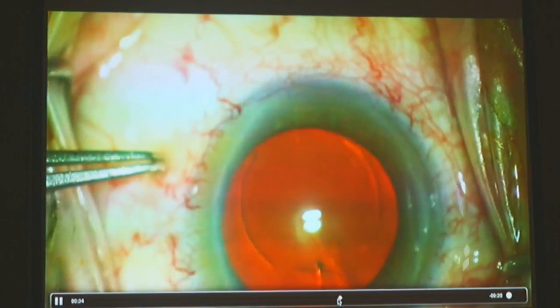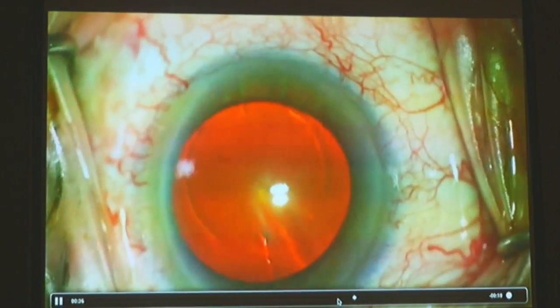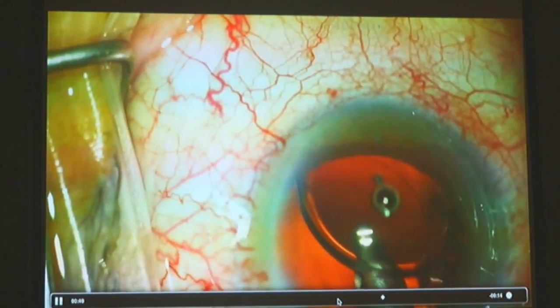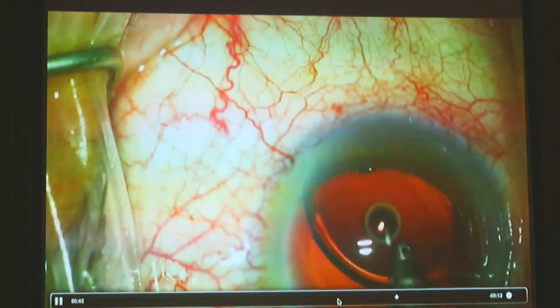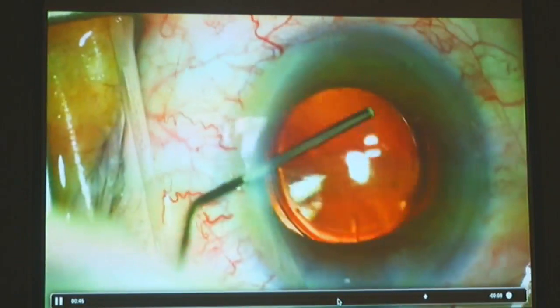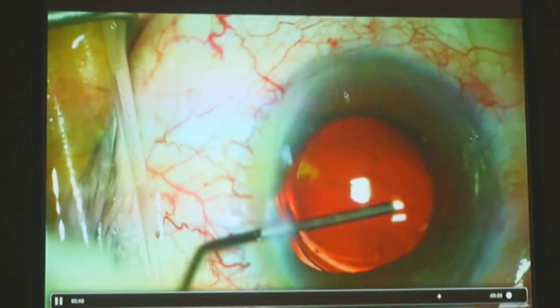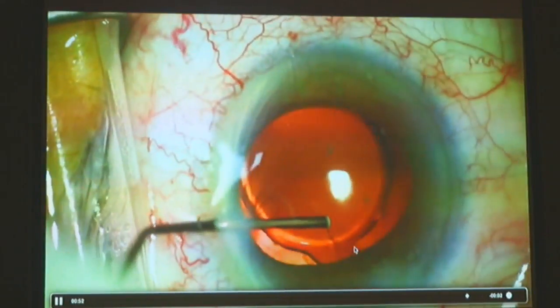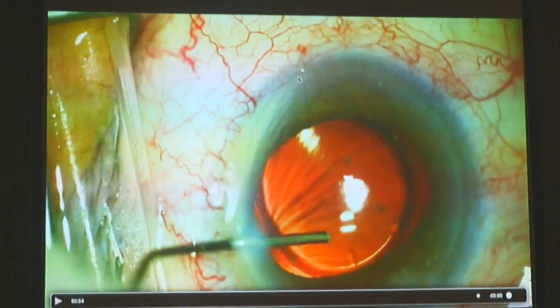And you see, by the way, I did not use ink. You know, ink gets messy. The ink spot itself is 5 degrees or more. So simply pressing on the cornea with a nice beveled indentation marker, you can see the marks show up even for 30, 40 minutes after the case, for those of you who take a long time for surgery, by the way. And you can see now with the cornea dry a bit, we have a nice position here as well.